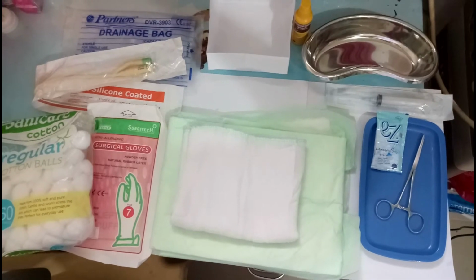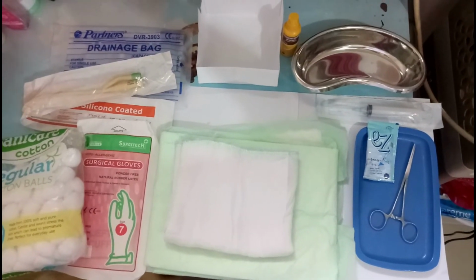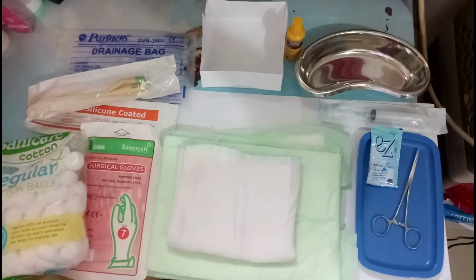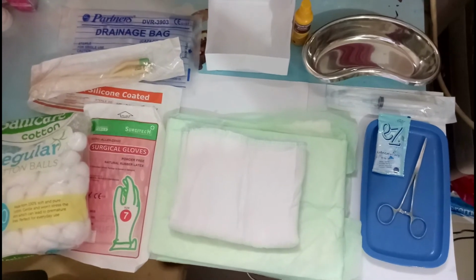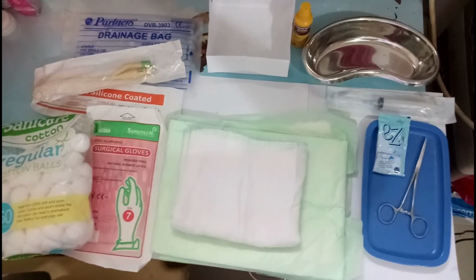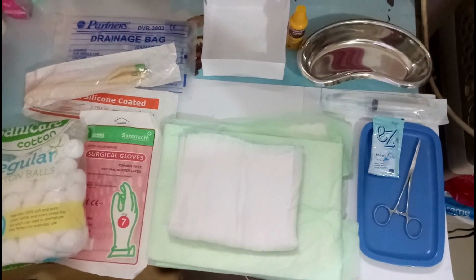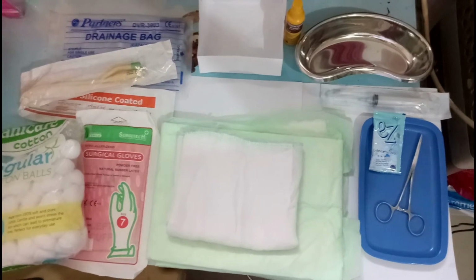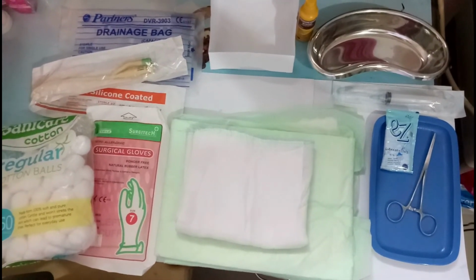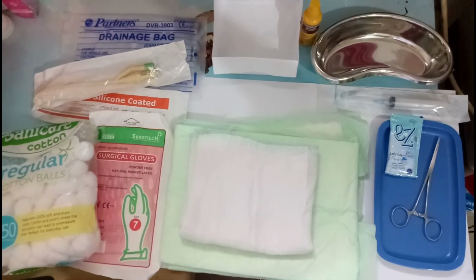So I have here a cotton ball, surgical gloves, Foley catheter, drainage bag, waste receptacle, betadine solution, easy lubricating jelly, a drape for the patient, which I prepared and will maintain the sterility of, and a kidney basin, medicine tray, and also a forceps tray. So now let's start and meet the patient.